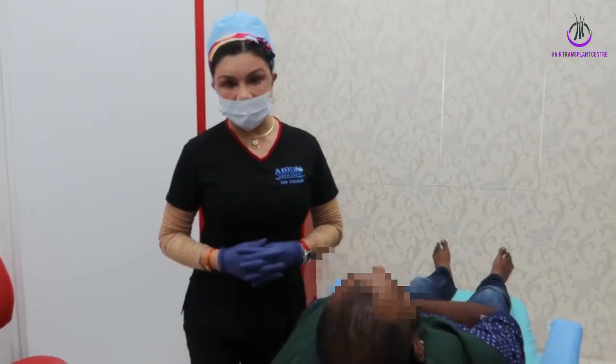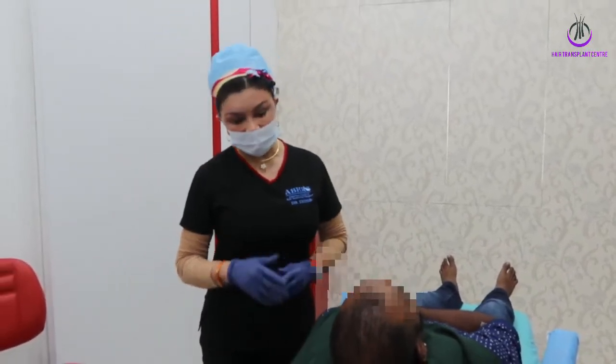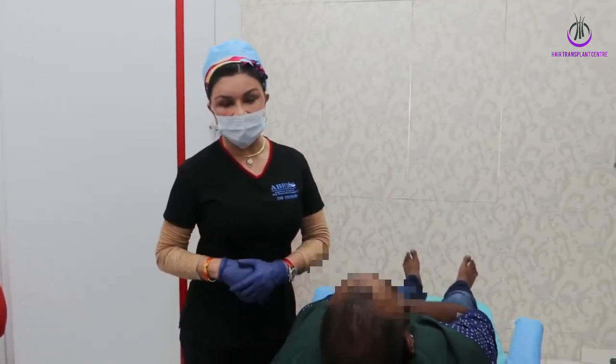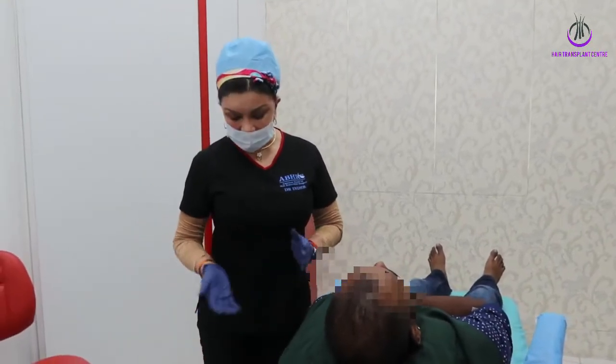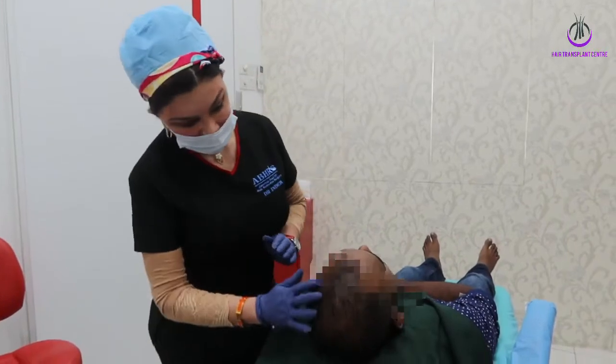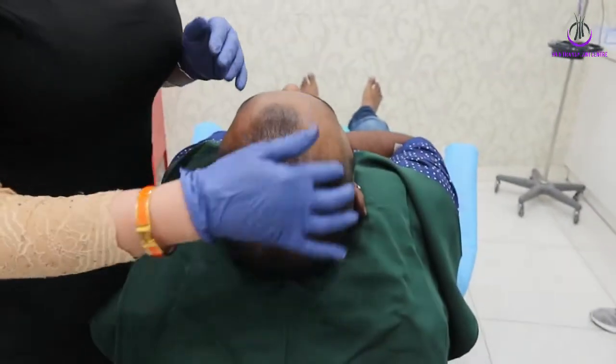Today I'm going to do my patient of 27 years old, fully shaven FUE. So the patient actually came to see me last year and asked me to do his hair restoration. I told him to go on medication first, and now his hair is better because of his young age, so I decided to do this hair transplant for him now.